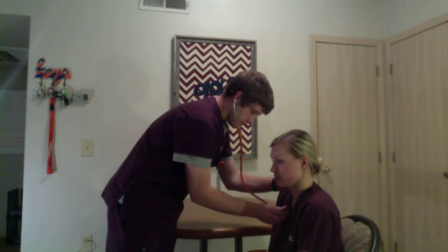So first I'm going to listen to her heart at the 4 different spots. We're going to do first the aortic, then the pulmonic, then the tricuspid, and then the mitral, which is where I'll listen to her apical pulse for a full minute. I'm just going to do 30 seconds for the video's sake, but in the hospital setting, we should go ahead and listen to it for a full minute. So I'm going to start here with the bell.